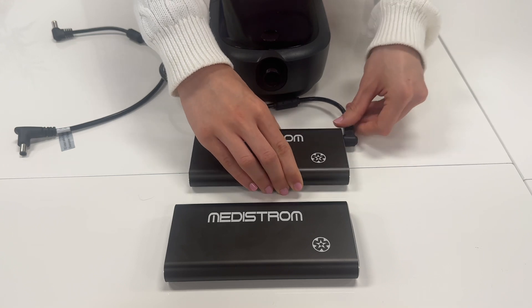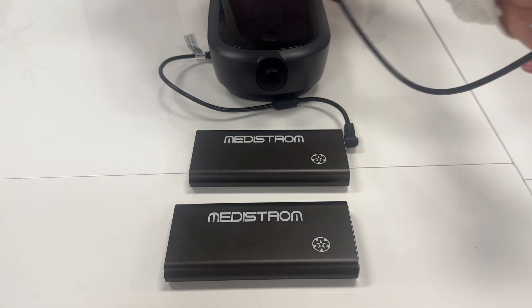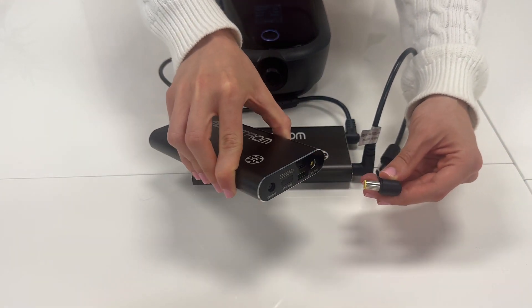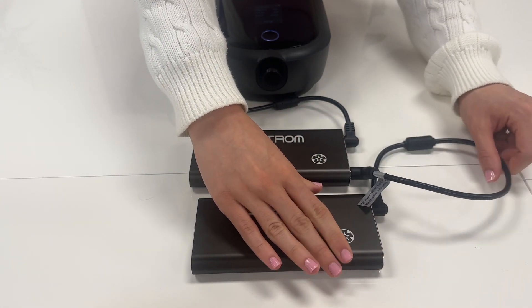Then, take the DC output cable for Respironics DreamStation 1, 2, and System 1 S60 and attach the black tip end of the cable to the black charge port of the primary PilotFlex battery. Connect the other yellow L-shaped tip of that cable to the yellow DC output of the secondary PilotFlex battery.